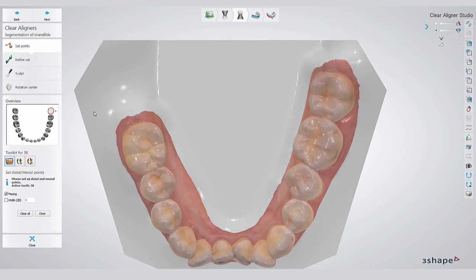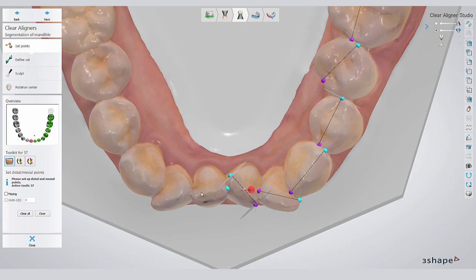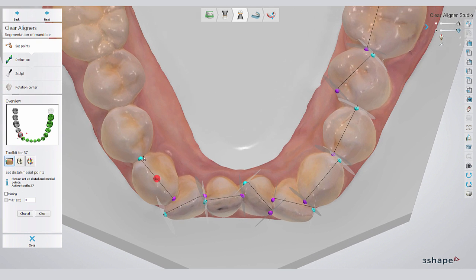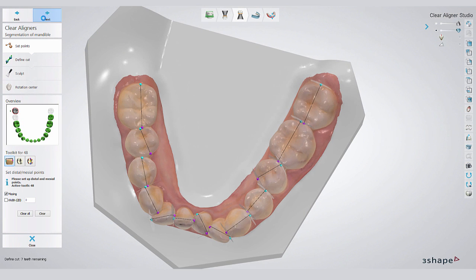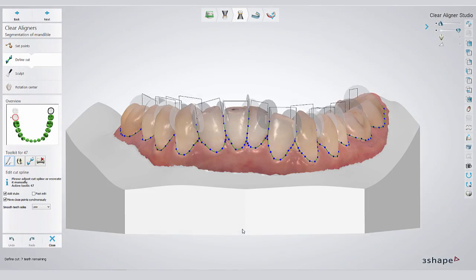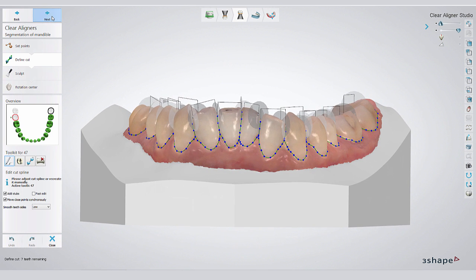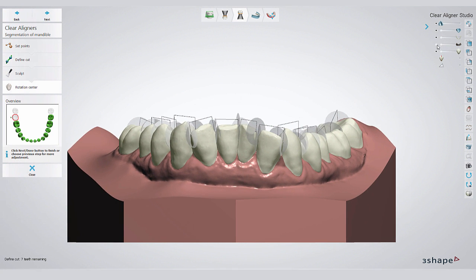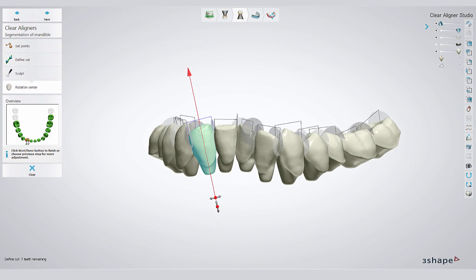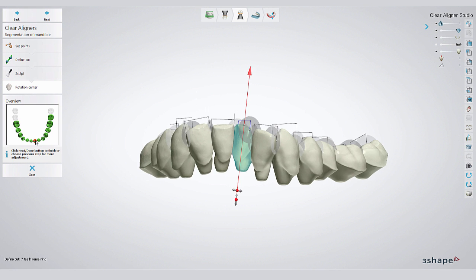You still have to apply the same process on the mandibular arch. We start again with selecting the distal and the mesial end for each tooth. Once you've finished with this process, the software will automatically detect the marginal line. You want to double-check this one as well. If you click on Next, you will be guided through the sculpting process. Finally, you want to double-check the long axis for each individual tooth, and probably correct it if necessary.